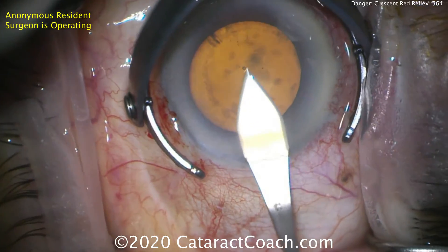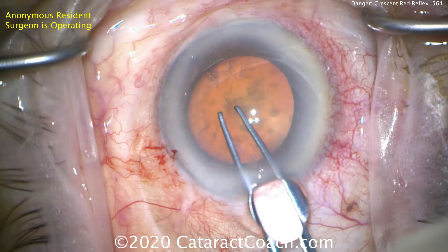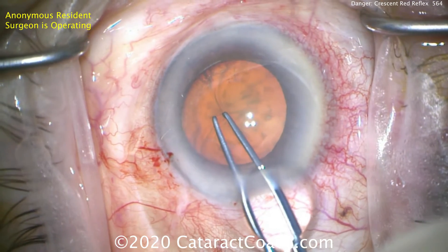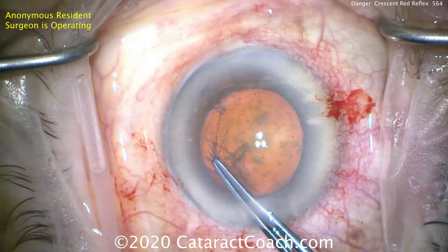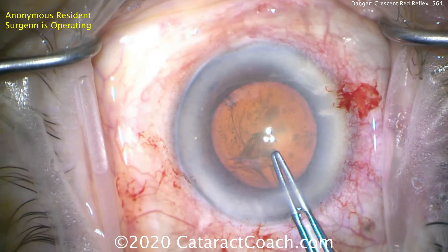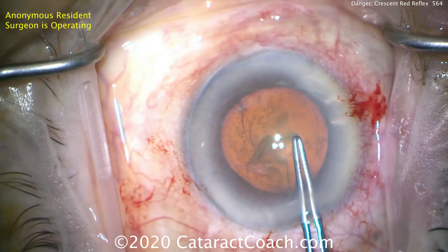When you try to go in with forceps to start the capsulorhexis, take a look at all that wrinkling. You can't even puncture it because there's so little support. So using a sharp cystotome is helpful. Even then, look at the wrinkling of the capsule as we complete a large capsulorhexis here.